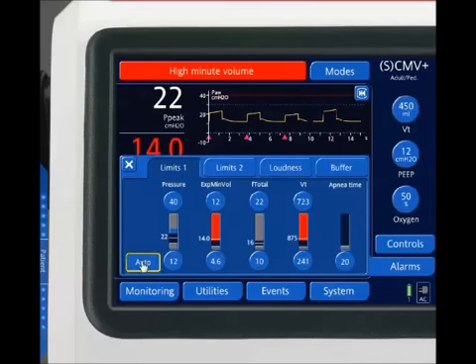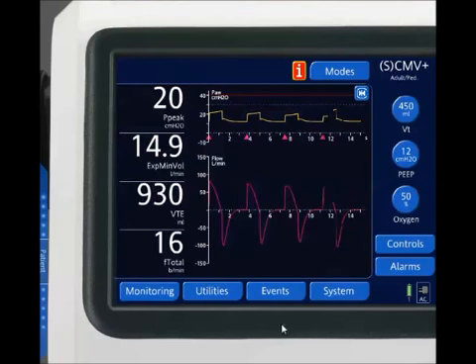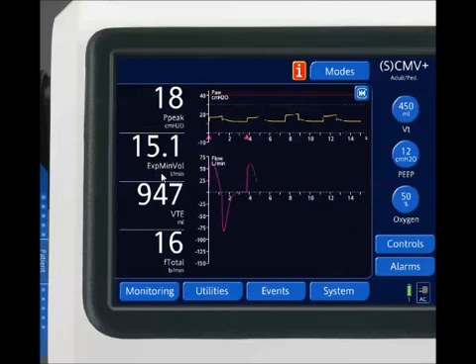I'm just going to reset my alarm so it's not alarming all the time. And this is the lag I was talking about in other videos. It takes some time for the peak pressure to start titrating down. So I can still have these large tidal volumes, double of what I've set, even in adaptive pressure control mode. I'll have that until my ventilator catches up, because it's only adjusting about 2 to 3 centimeters of water between breaths, every breath.